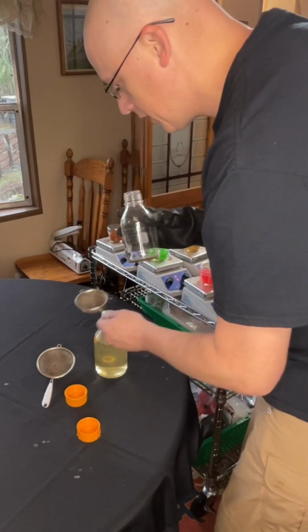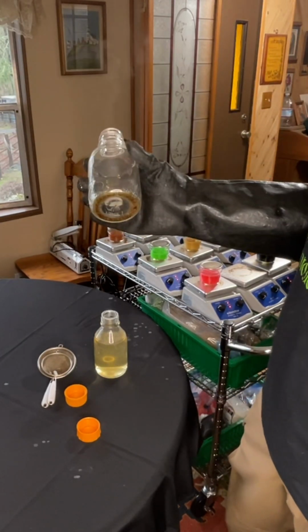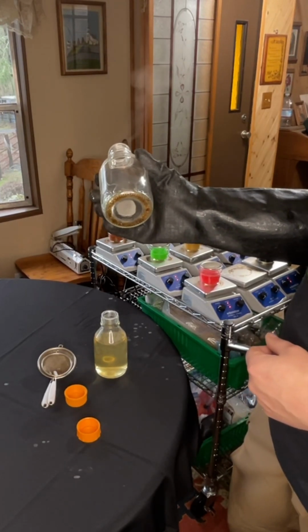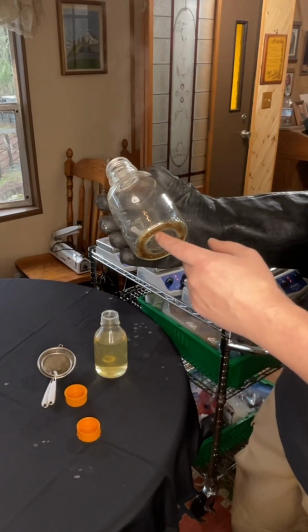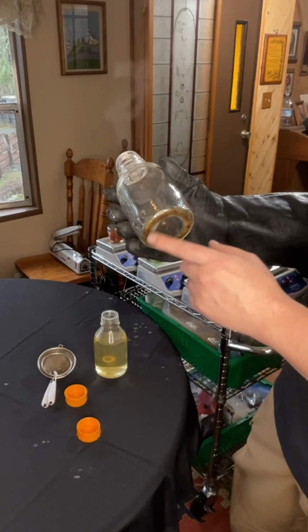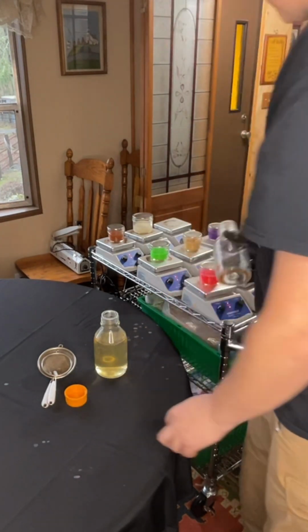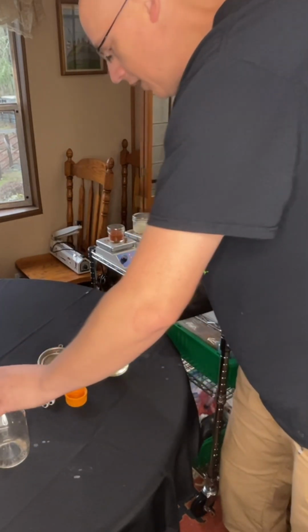Now another interesting note here is you can kind of see the browning on the bottle here. This is what happens when you use one of these wide mouth jars or wide mouth media bottles on these magnetic stirrers, and you have powder that settles in this ring and it gets heated up too much. It scalds it and turns it brown and crispy. So if you happen to be using a magnetic stirrer and running into having some chunkies left over at the end, you know what you've got going on.